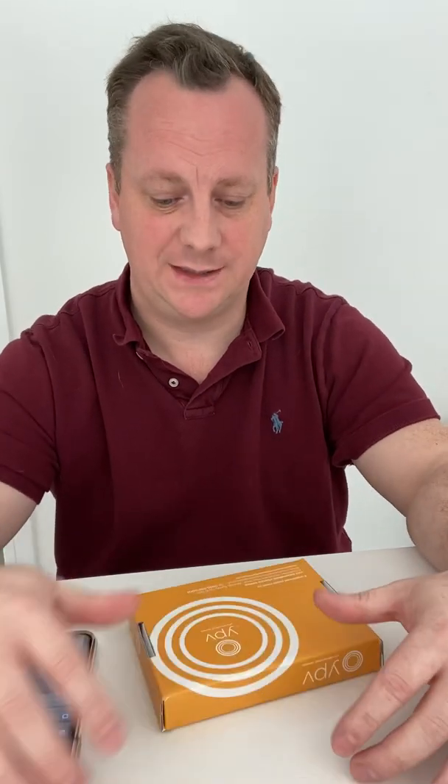Hello there. Today we're going to have a look at the YPV Your Personalised Vitamins Vitamin D Home Test Kit. It comes in really attractive packaging and it comes straight to the letterbox.